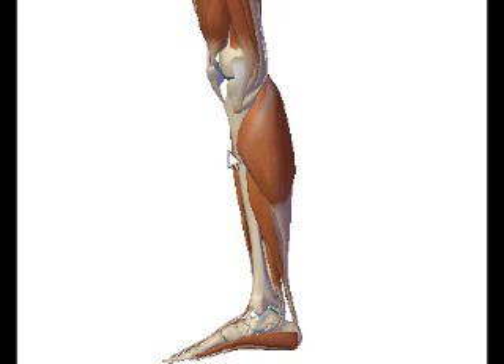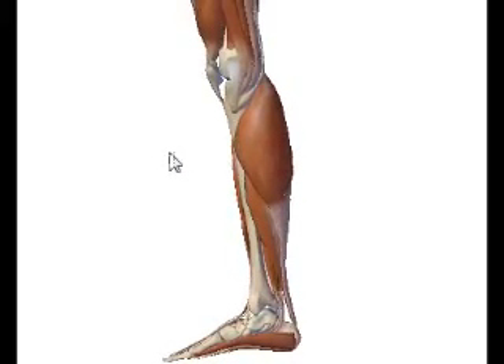This quick video is for Septembergirl59. I will do my best to try and answer your question for a weight-bearing lateral knee.